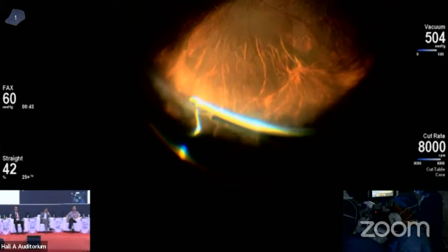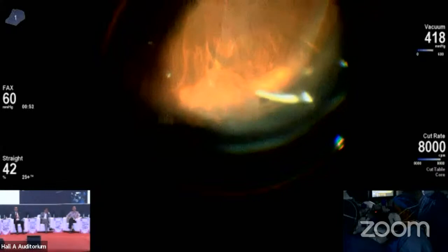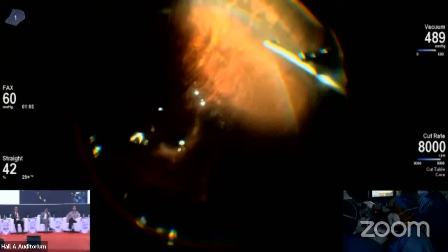You have to screen the periphery, but in myopes, sometimes it becomes very difficult to identify the small breaks. It's very important to clear the area of the break from the anterior vitreous. So that is what we are just doing.